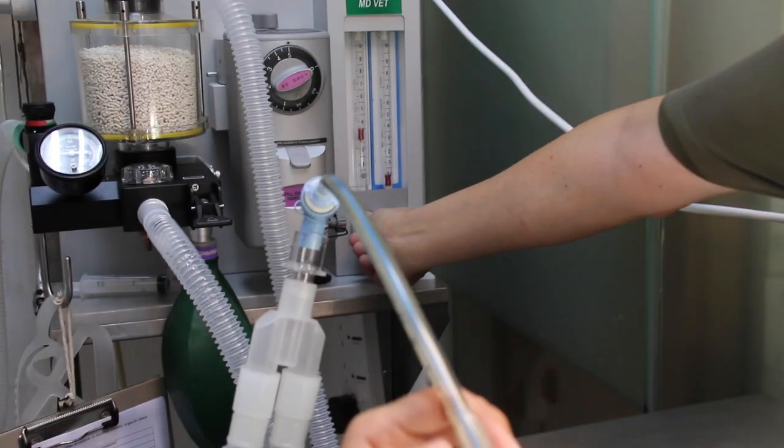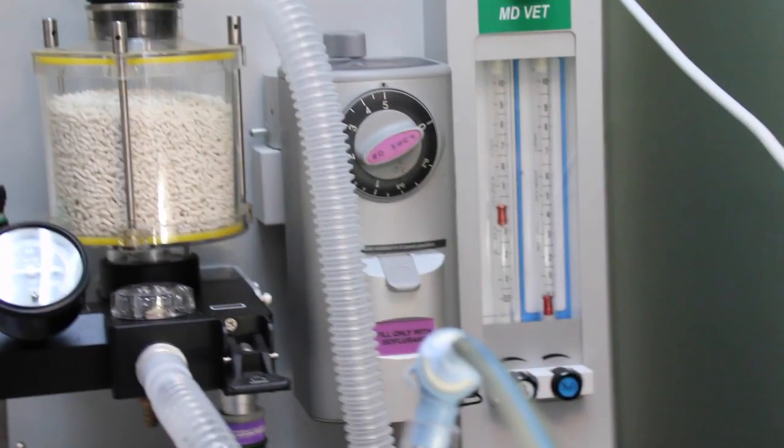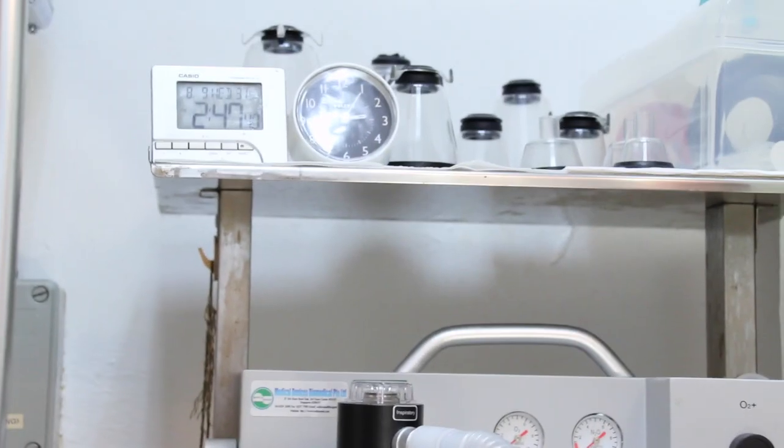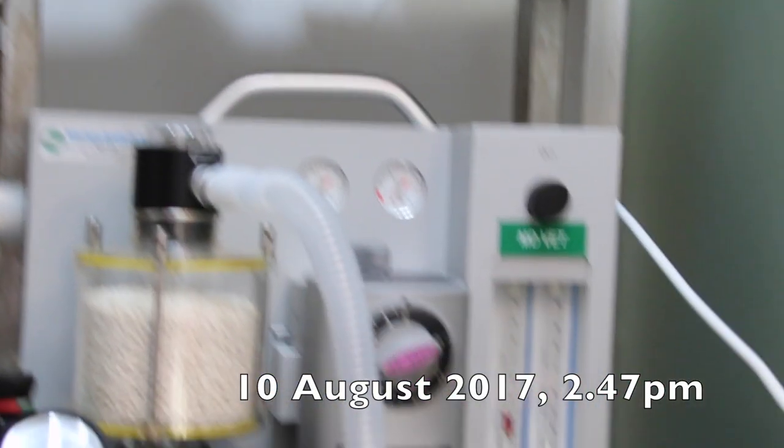Firstly, since the hamster was very nervous and in pain, it was given inhalational anesthetic gas to calm it down. The machine was set to 5% isoflurane, which is general anesthesia. When giving anesthesia, the time of administering should always be noted down. In this case, it was done at 2:47pm.